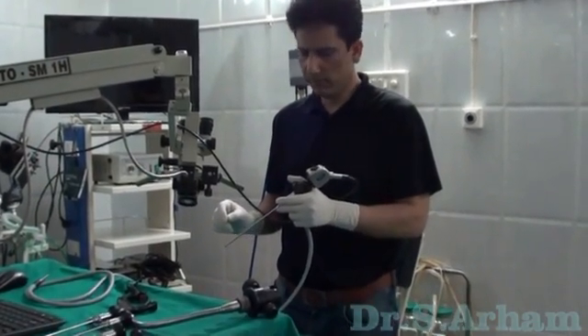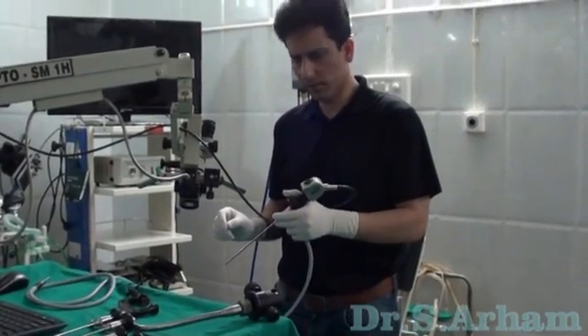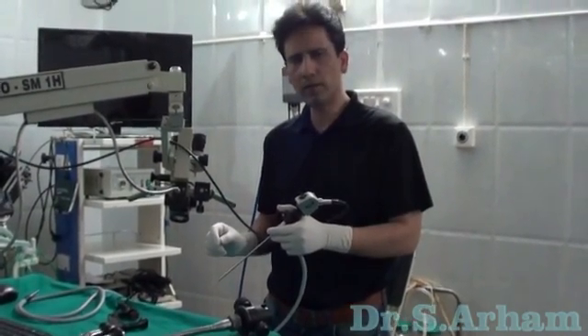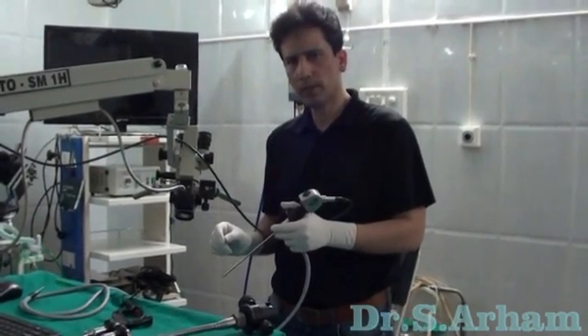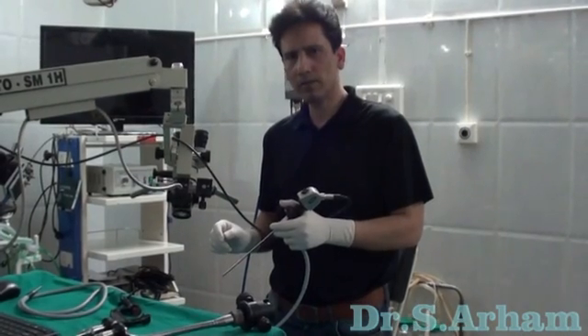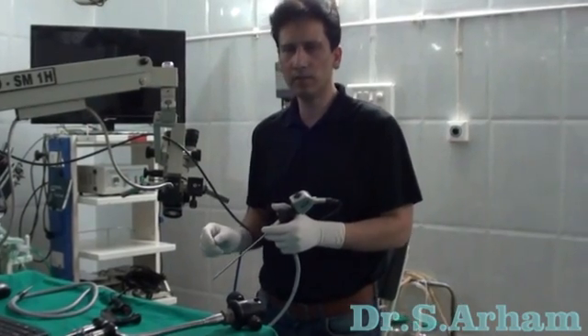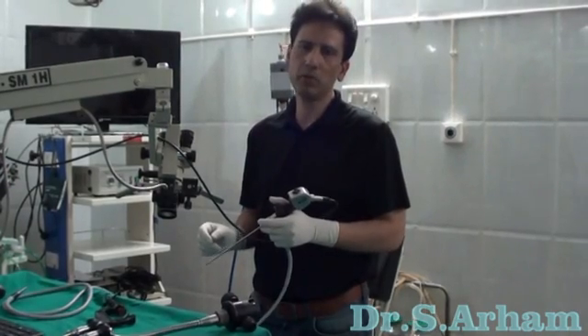When one of your hands is busy, engaged holding the endoscope and the camera, you can never do any ambidextrous job which is required in mastoid exploration or cholesteatoma surgery, or quite often in even simple ear surgeries like tympanoplasties. You have to have both your hands free.